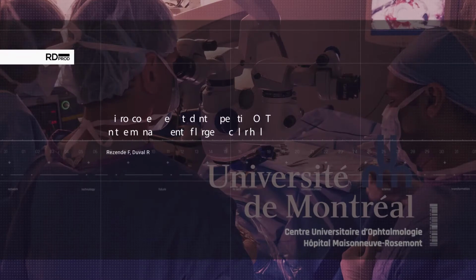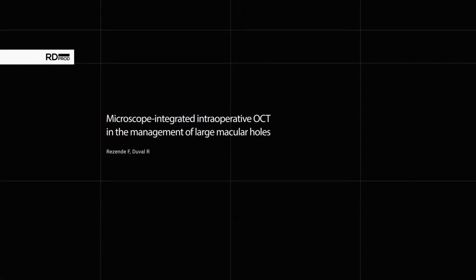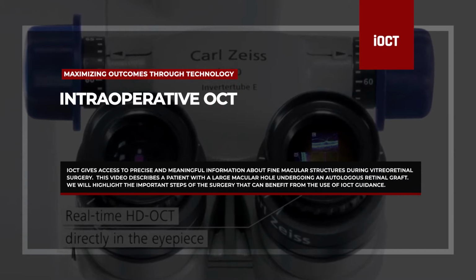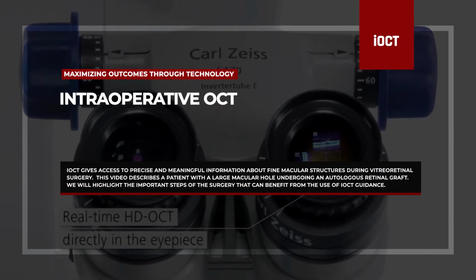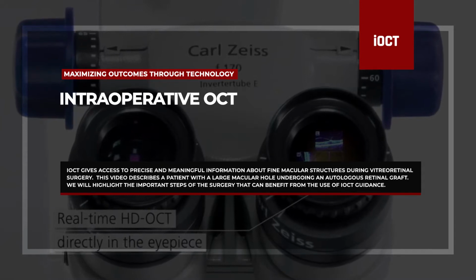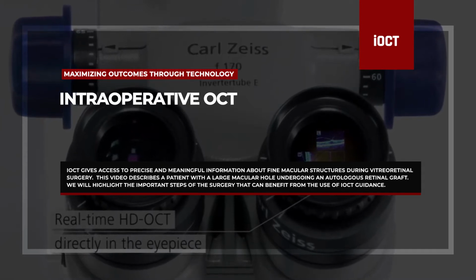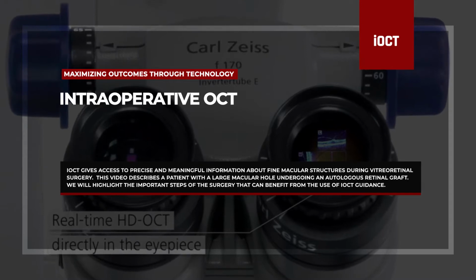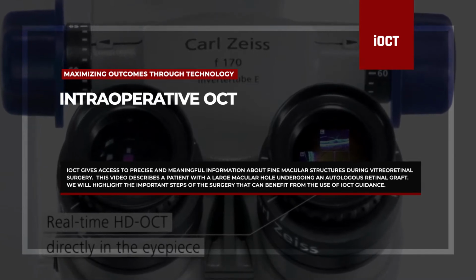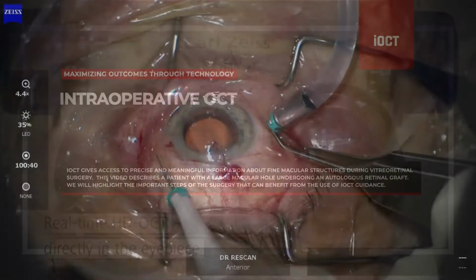Microscope-integrated intraoperative OCT in the management of large macular holes. Intraoperative OCT gives access to precise and meaningful information about fine macular structures during vitreoretinal surgery. This video describes a patient with a large macular hole undergoing an autologous retinal graft. We will highlight steps of the surgery that can benefit from the use of IOCT guidance.